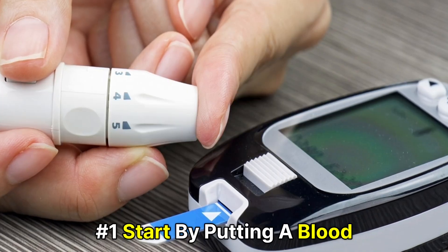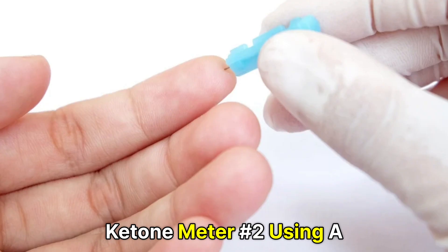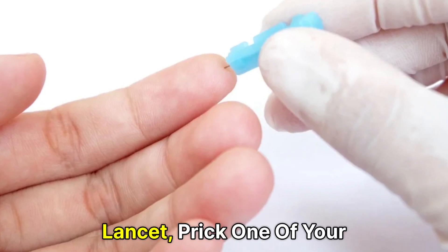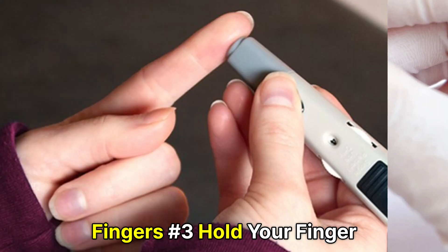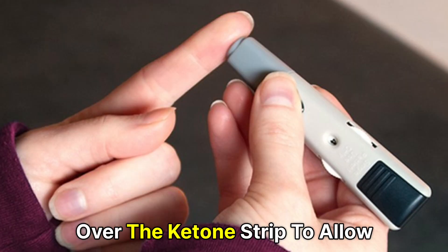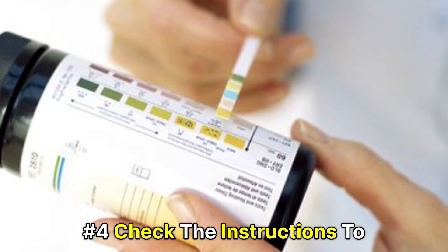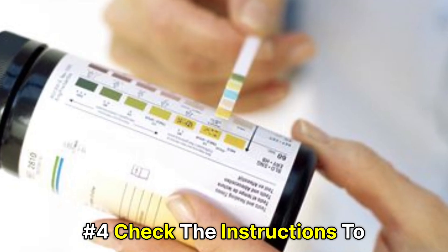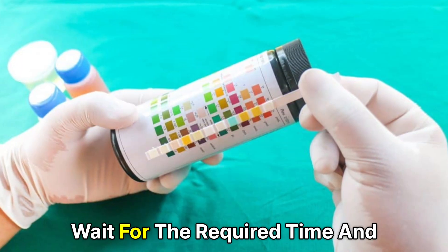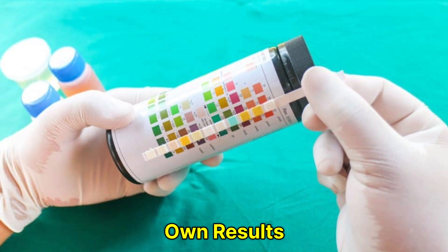Number 1: Start by putting a blood ketone strip into the blood ketone meter. Number 2: Using a lancet, prick one of your fingers. Number 3: Hold your finger over the ketone strip to allow some drops of blood into it. Number 4: Check the instructions to know how long you should wait to get the result. Wait for the required time and check your ketone results.